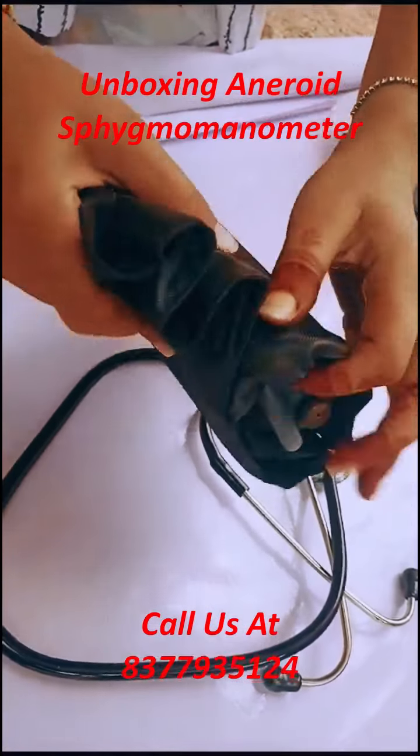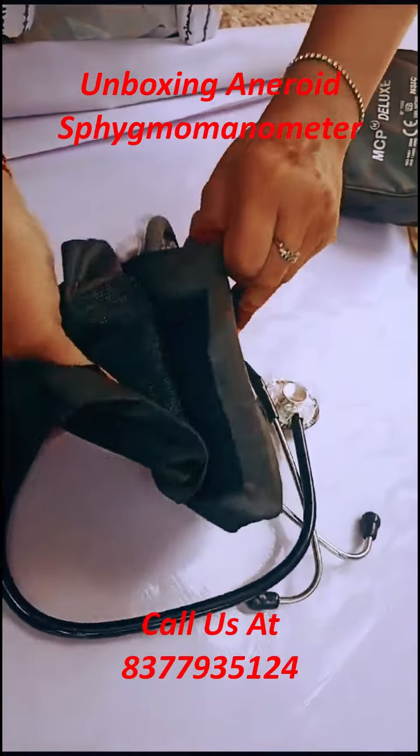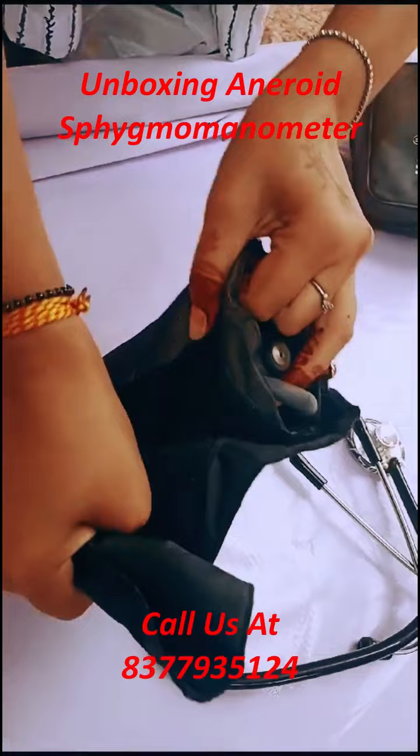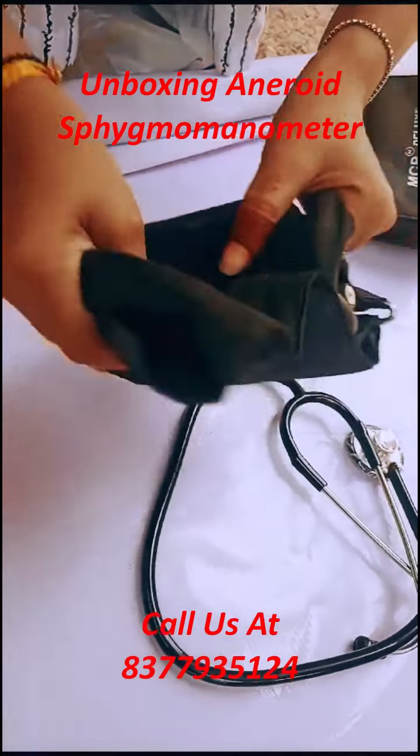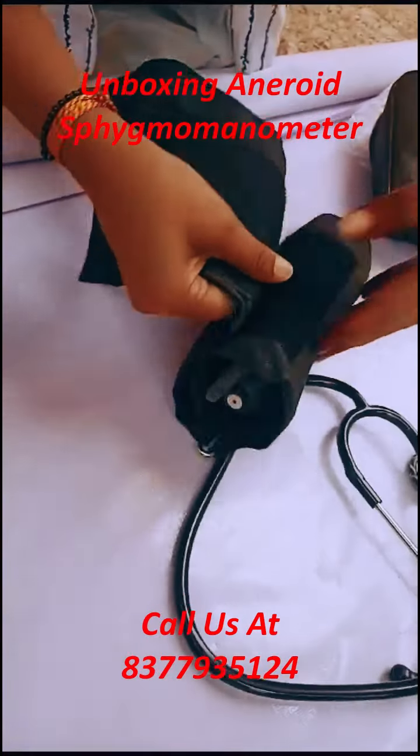An Aneroid sphygmomanometer is a manual blood pressure measuring instrument in comparison to the digital blood pressure monitors you see. You have to manually inflate and read the measurements by taking systolic and diastolic pressure.